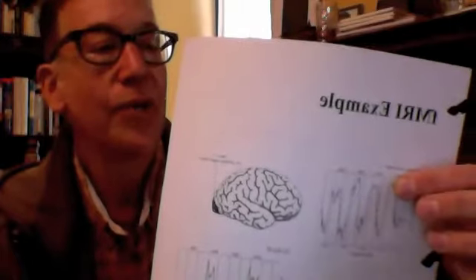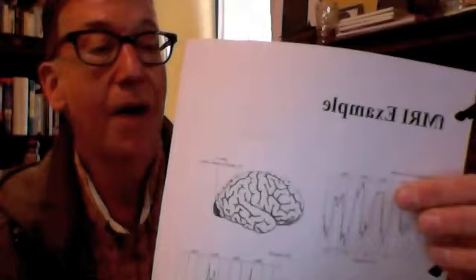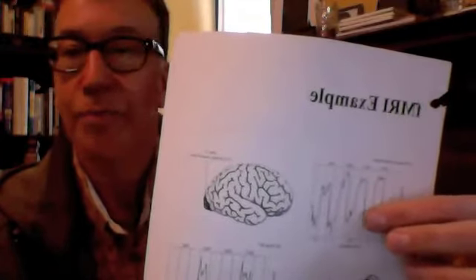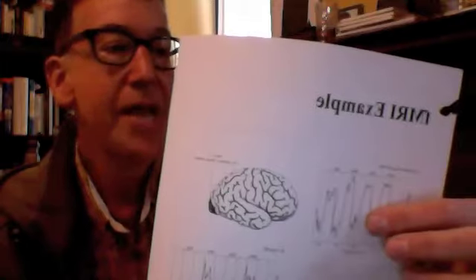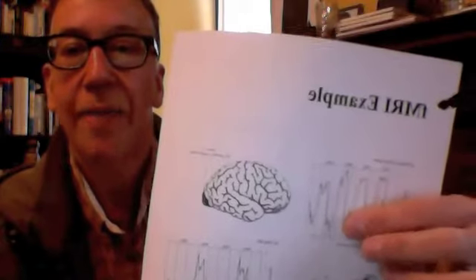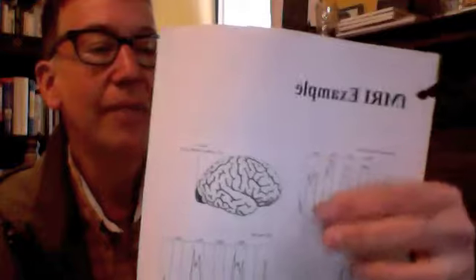This means more oxygenated blood is flowing, and they're detecting more hemoglobin with oxygen in this region when you present something visual on the screen. Then you drop back to a blank background and go back to your baseline signal in terms of blood flow. Then you go to the stationary dots, and you see again an increased signal, and then back to a blank background, and there's nothing. And then back to moving dots, and then back down here.